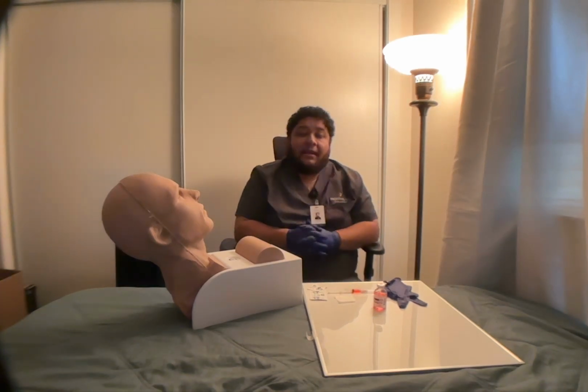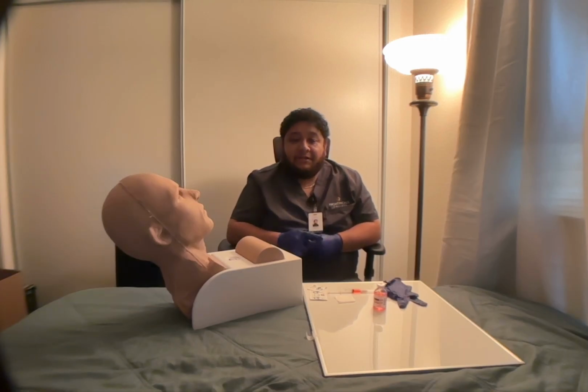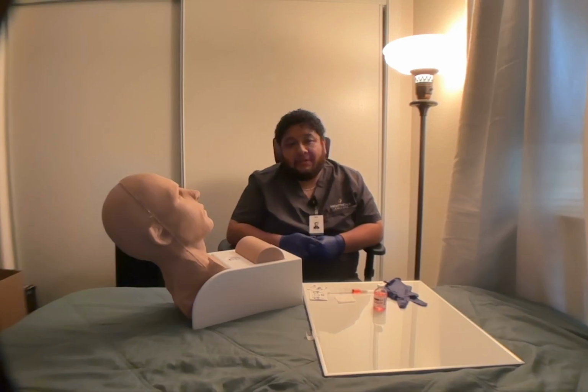Okay, now that I've drawn the medication into the syringe, I will look for the injection site. For this injection site, I will use the ventrogluteal muscle. To locate the ventrogluteal site, first I'm going to ask my patient for permission.